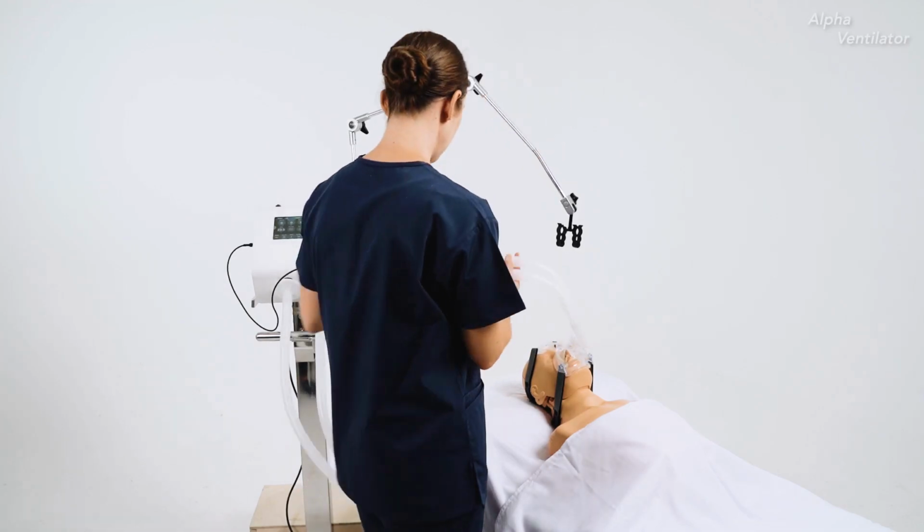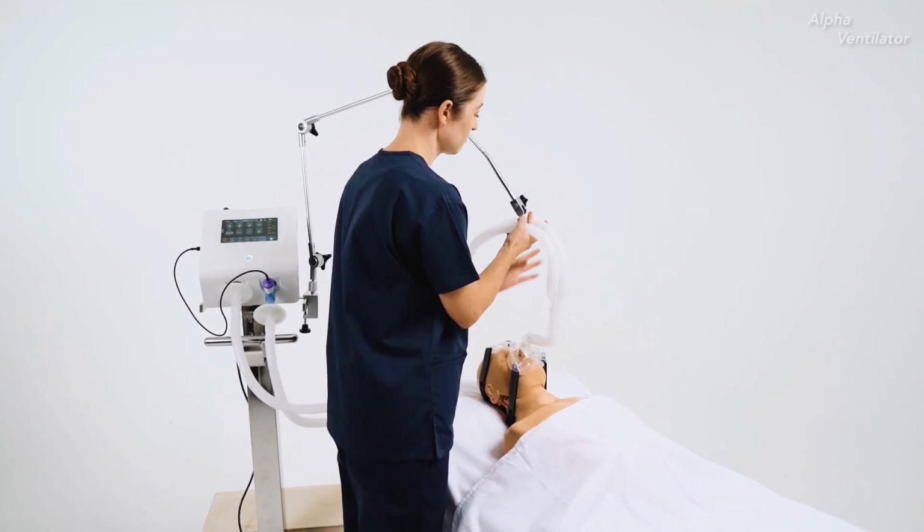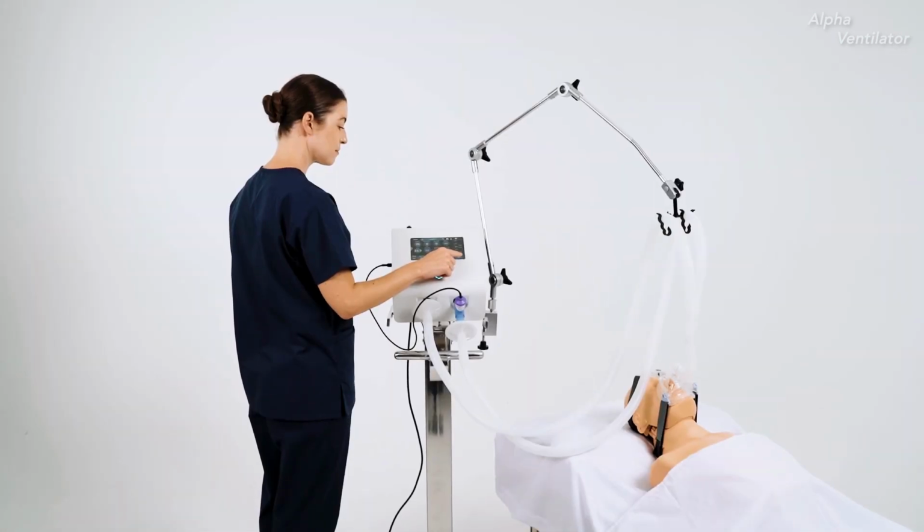When the ventilator setup is complete, connect the patient port to the patient's airway and start the ventilation.